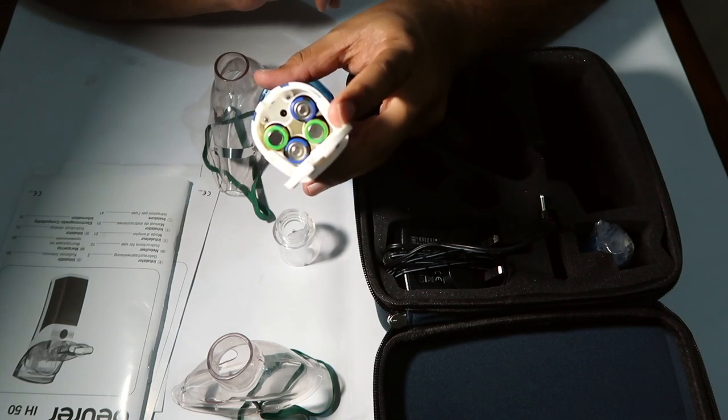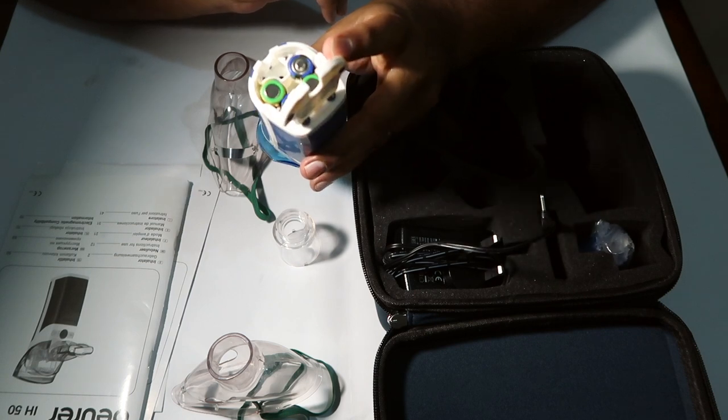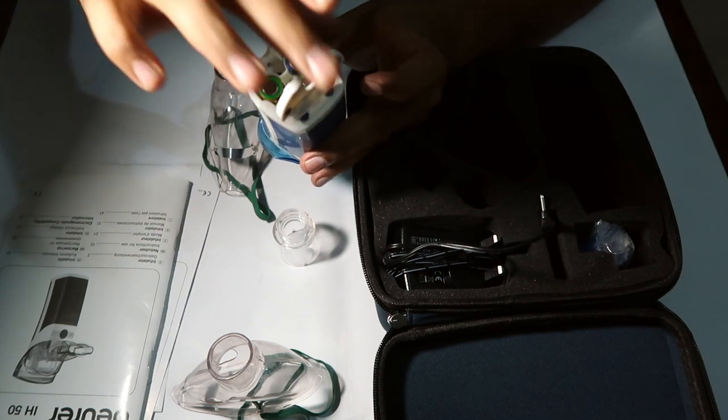I will use the travel unit to get anywhere. If you are on a bus or flight, you can use it with the battery.